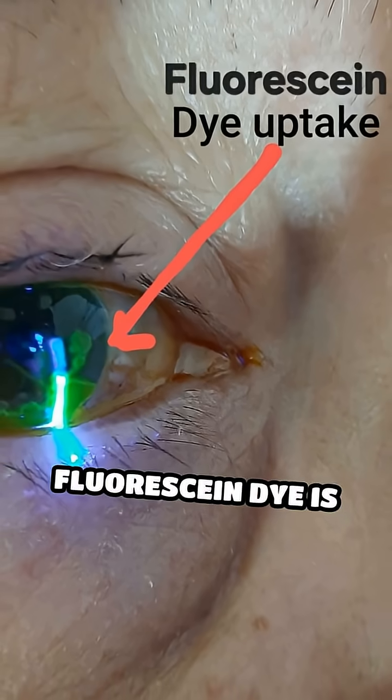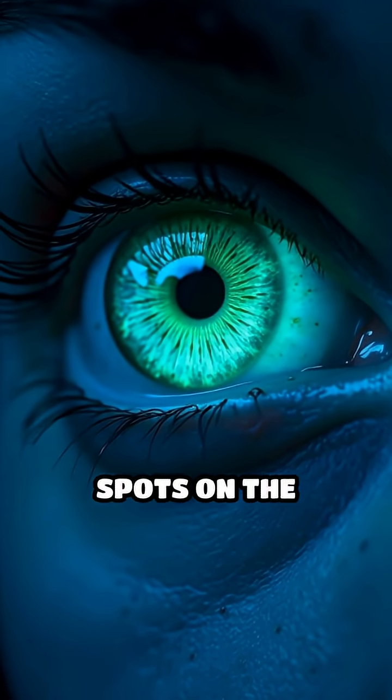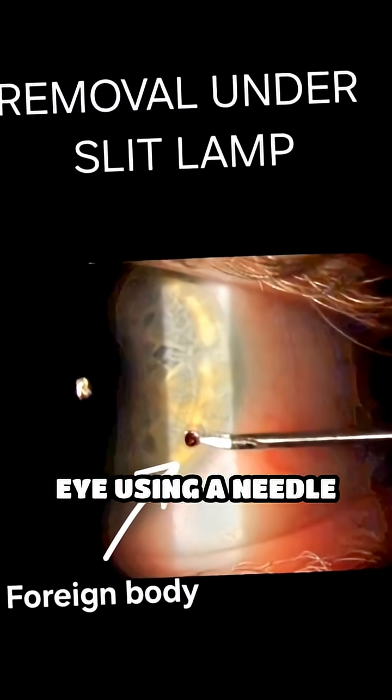Sometimes fluorescein dye is applied to the eye's surface to highlight scratches, ulcers, or dry spots on the cornea. This is also how we are able to carefully remove a foreign body that is lodged in your eye using a needle tip.